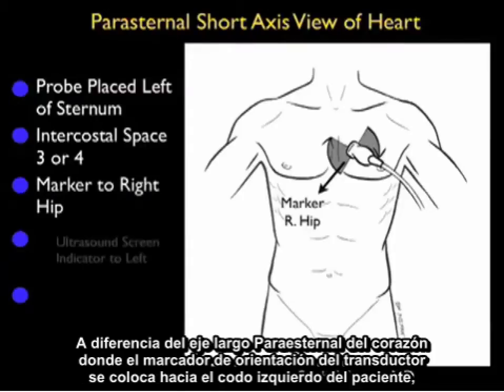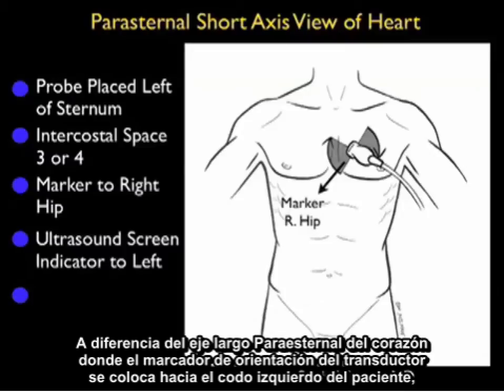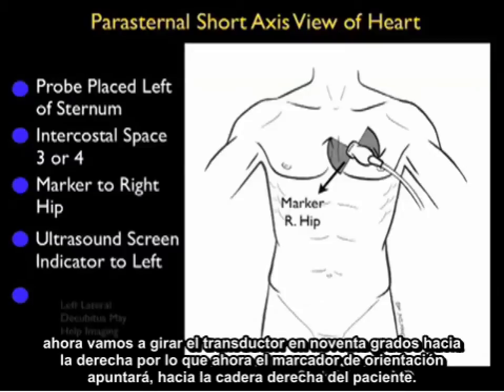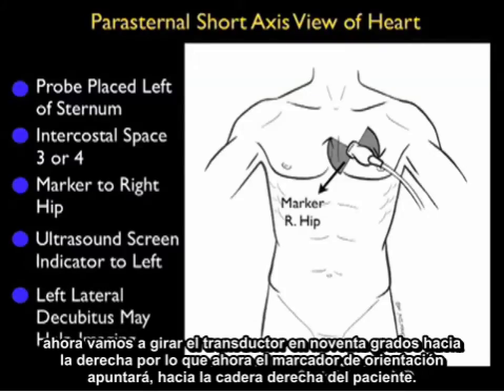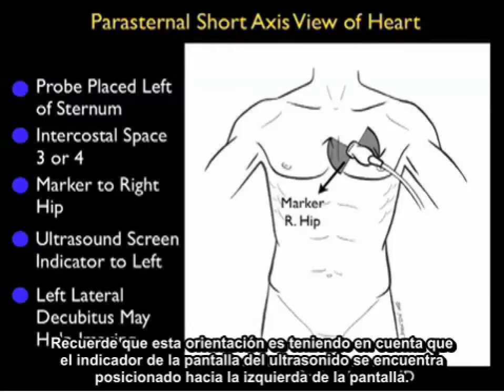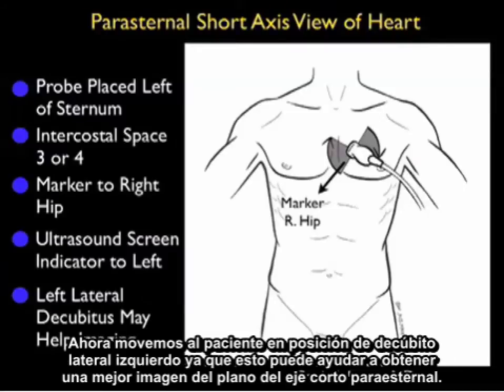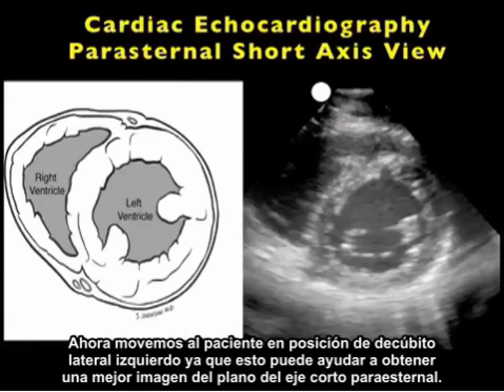In variance to the parasternal long axis view of the heart, where the probe marker was positioned down towards the patient's left elbow, we'll swivel the probe 90 degrees clockwise, so now the marker is down towards the patient's right hip. That's with the caveat that the ultrasound screen indicator is positioned towards the left of the screen. Moving the patient into left lateral decubitus position may help imaging from the parasternal short axis plane.